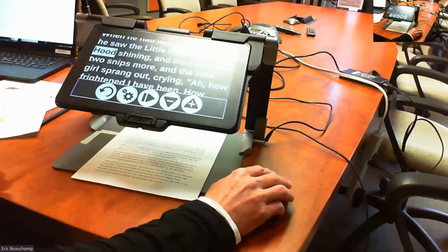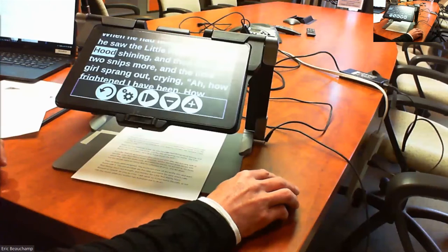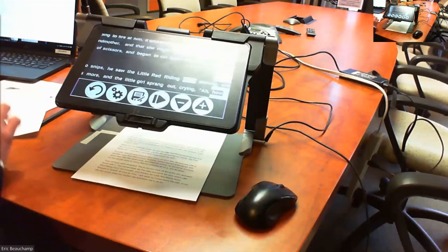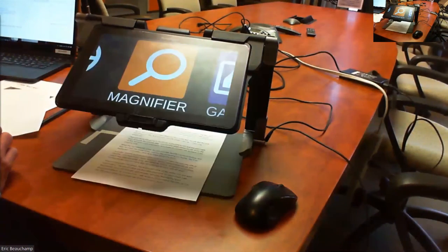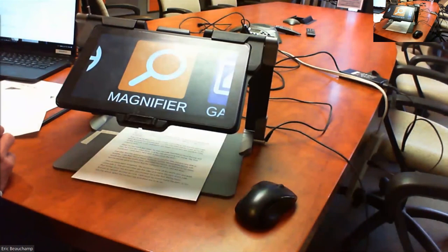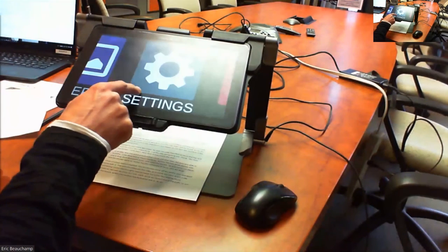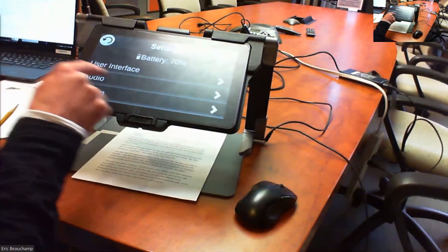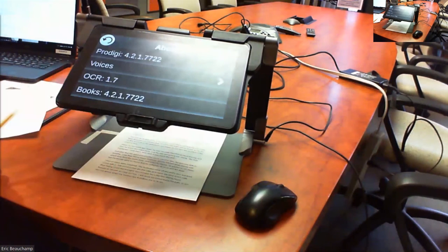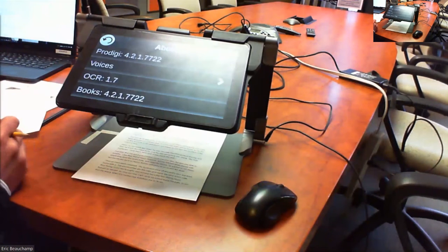All right, so we're almost done here. It's been quite a morning. I love your questions. I'm going to end just by showing you one thing, and it's the most important thing. I should have started off with it, but right now the most recent version of the Mat Connect software is, I'm going to show you how to see it. You can go into settings, into the About menu, and the latest version that we're on right now is 4.2.1.7722. That's the most recent version.